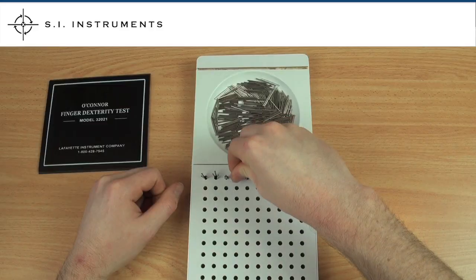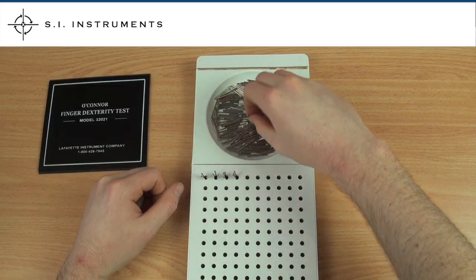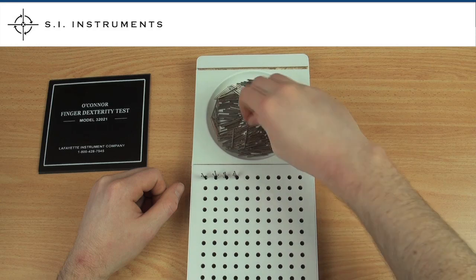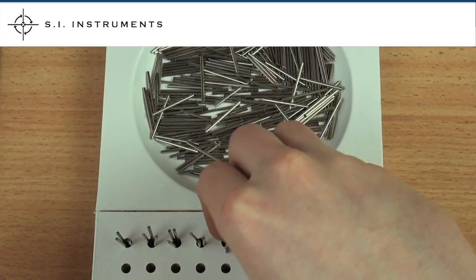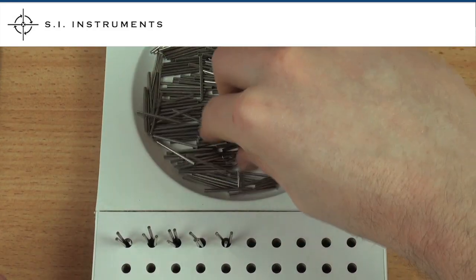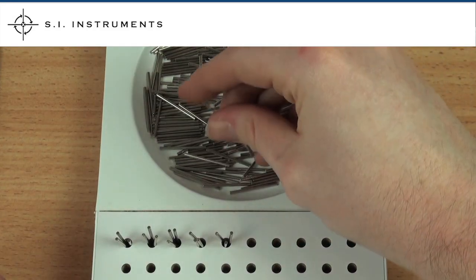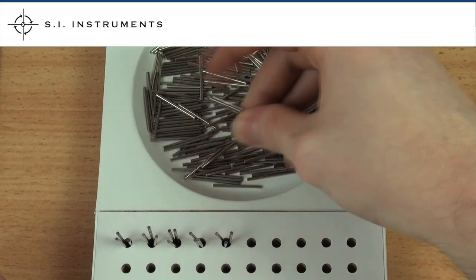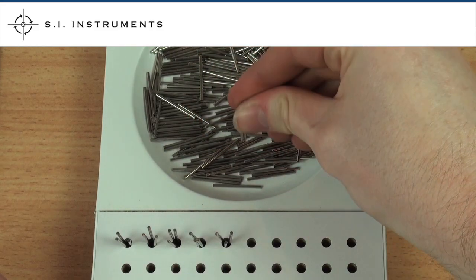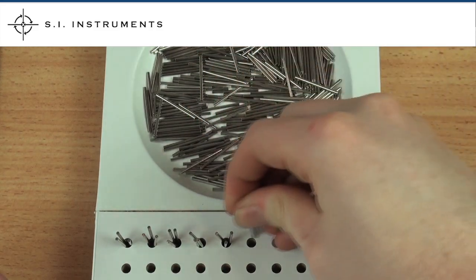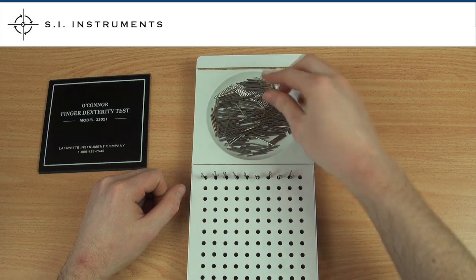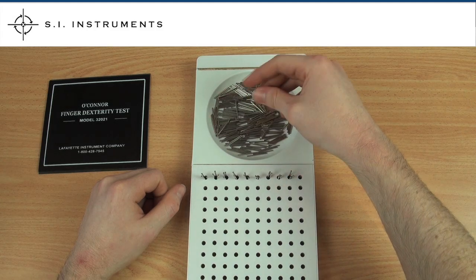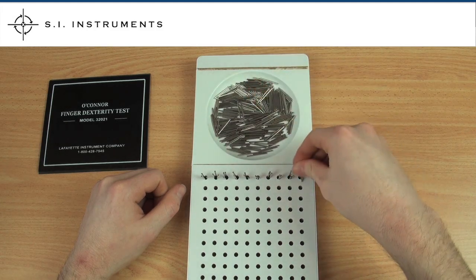The test is performed by picking up three pins at a time and placing them in the holes as fast as possible, starting in the corner farthest from you, working left to right or right to left depending on what hand you are using. The test ends once all holes are filled.